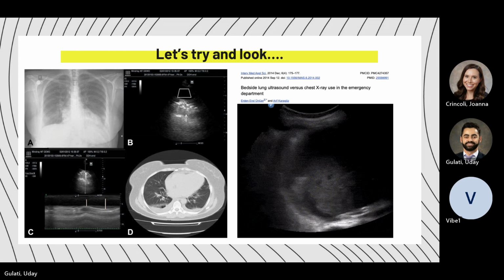Yeah, absolutely, right? You guys are masters now at reading chest X-rays, and for the ER residents, the IM residents, the TY residents, and the surgery residents, you will all obviously become masters at this as well. Maybe not the ortho residents, but that's okay. And so, absolutely, these are all things that you're delineating.